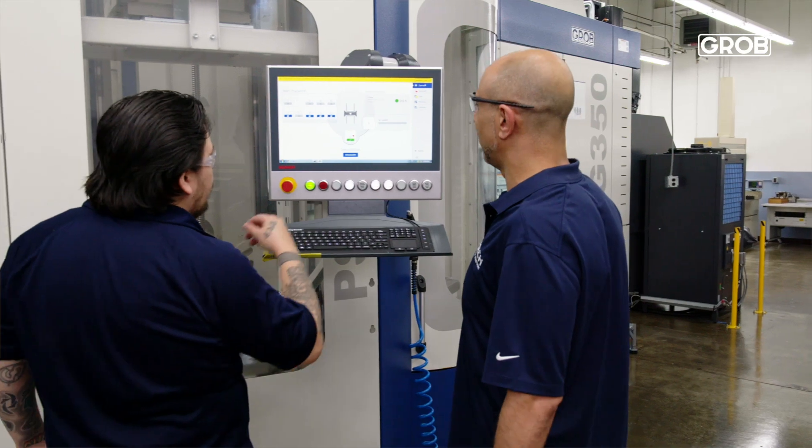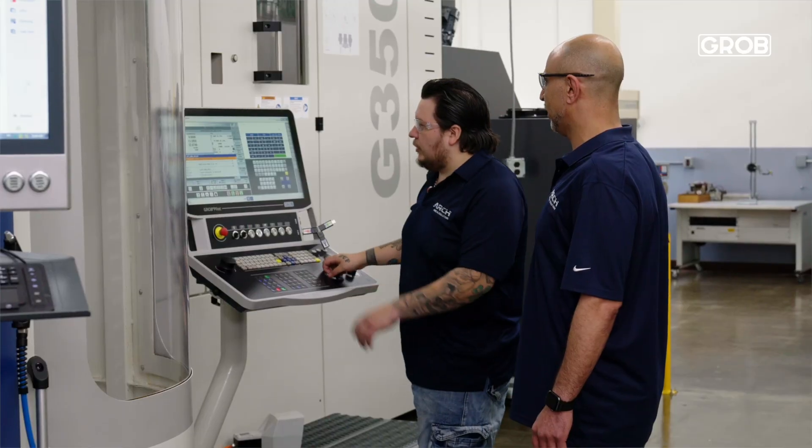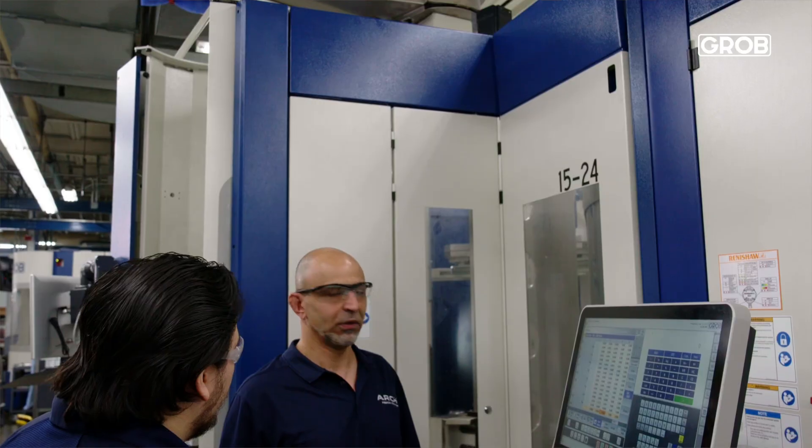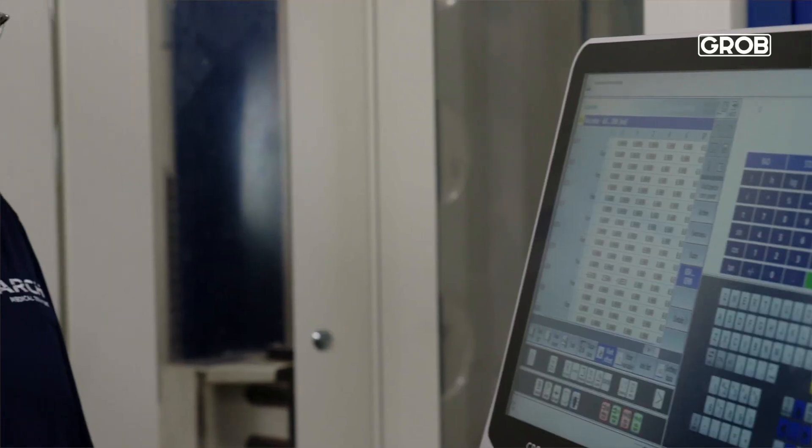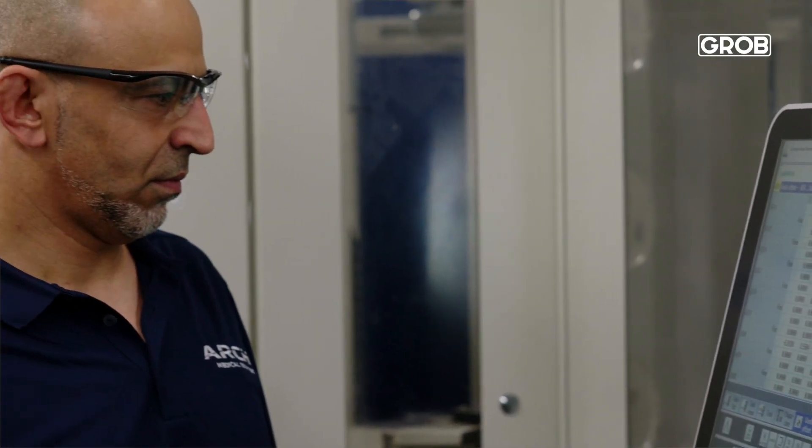We had an engineer that came in with little to no experience with the Grobe itself and was actually able to get a job that was due within a month done in a week. It was very impressive to see that we were able to do the five-axis movements and hold those tight tolerances. I've watched Jonathan, the setup technician, and how he set it up — when you're setting up the jobs, you're going through down the list and inputting all that stuff, and it takes seconds versus minutes. That's really good for programmers and engineers running in the background. Anything that makes our job easier is a home run for me.